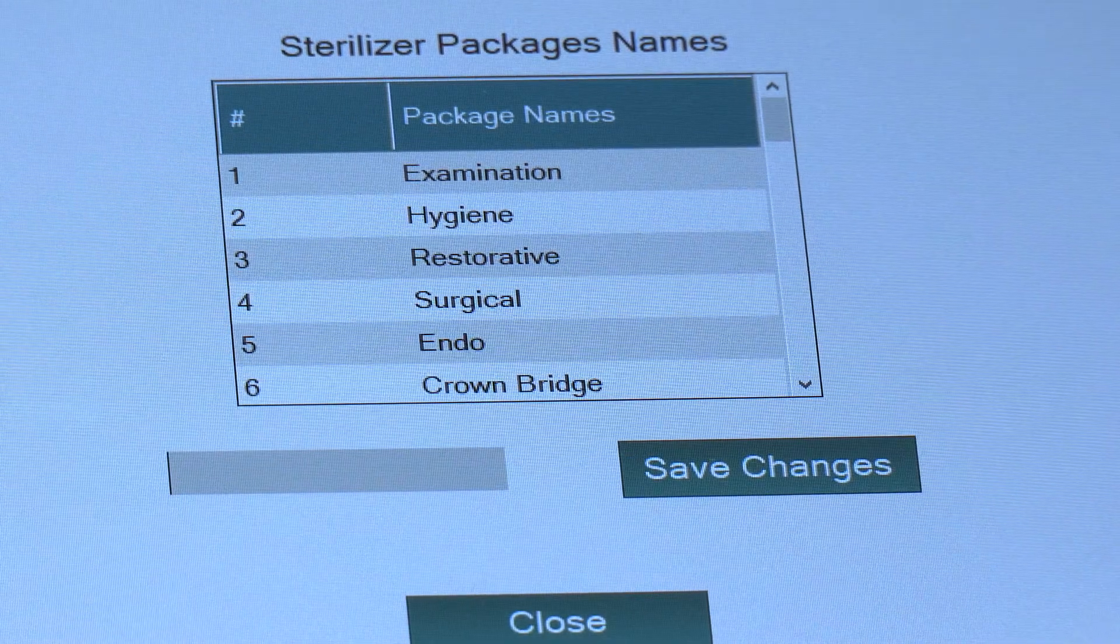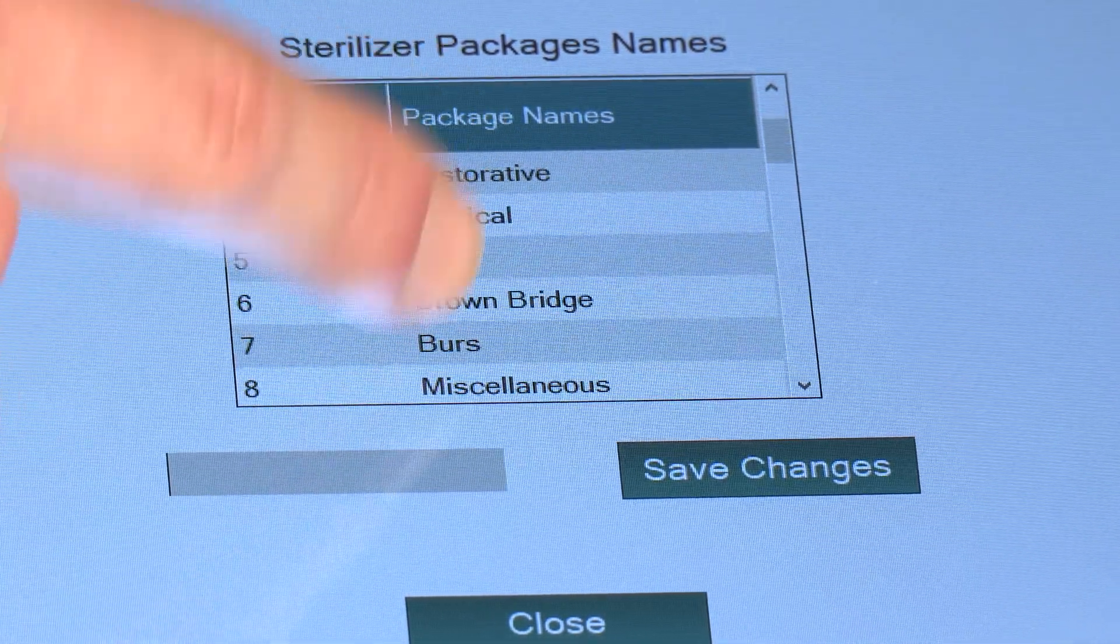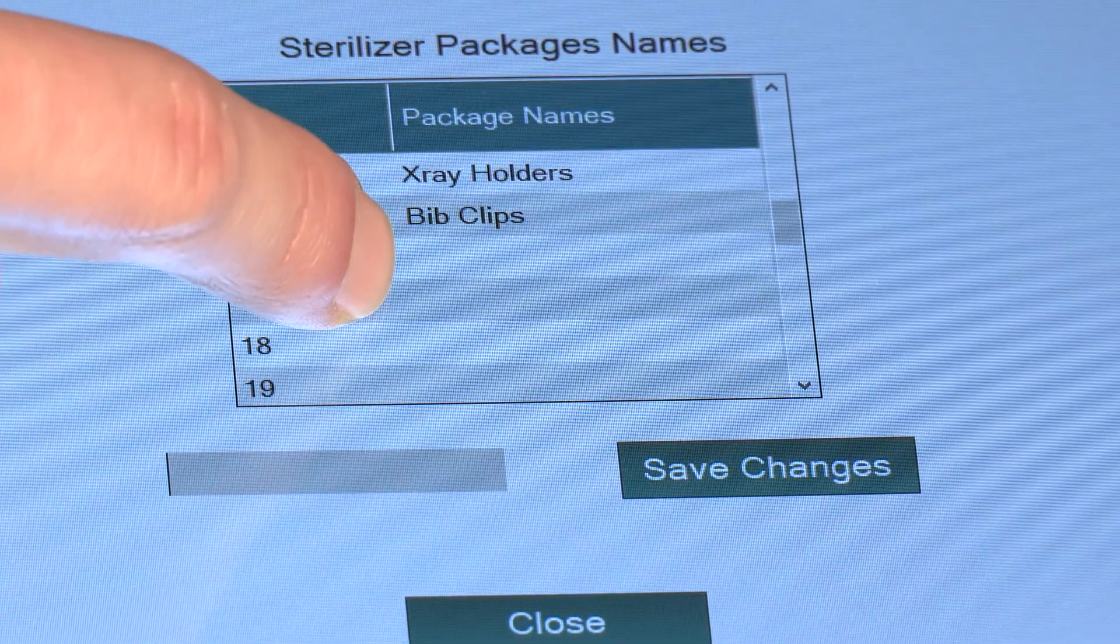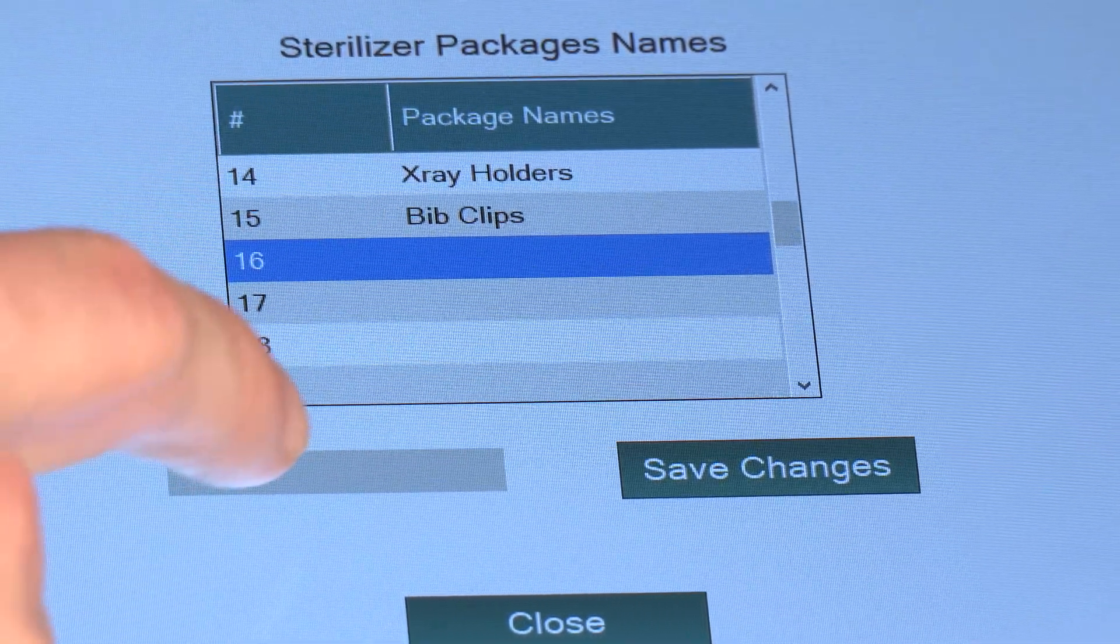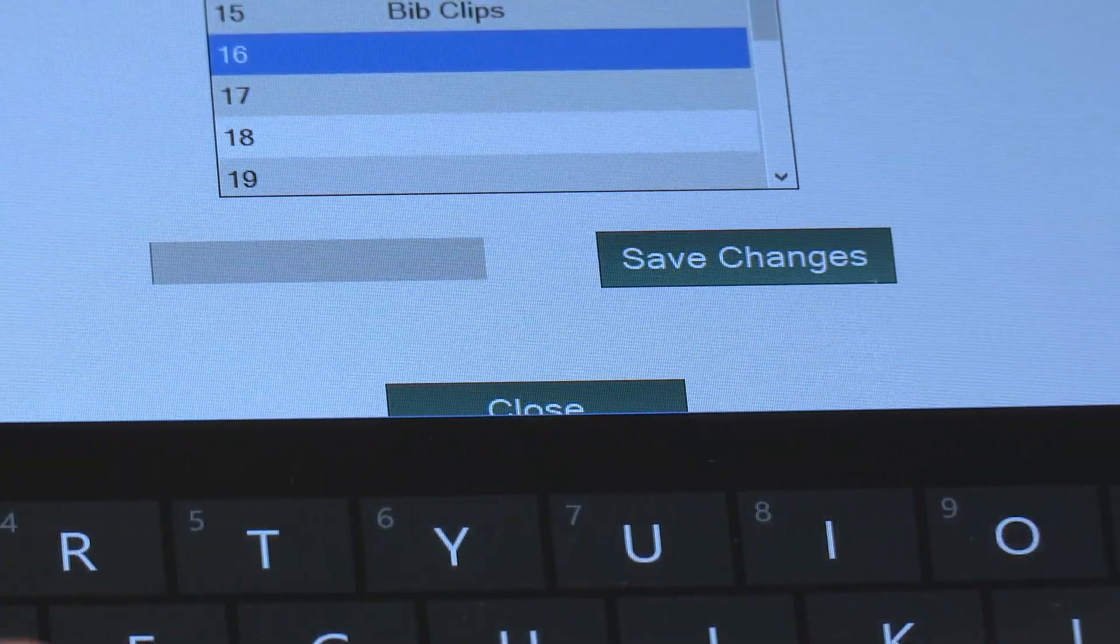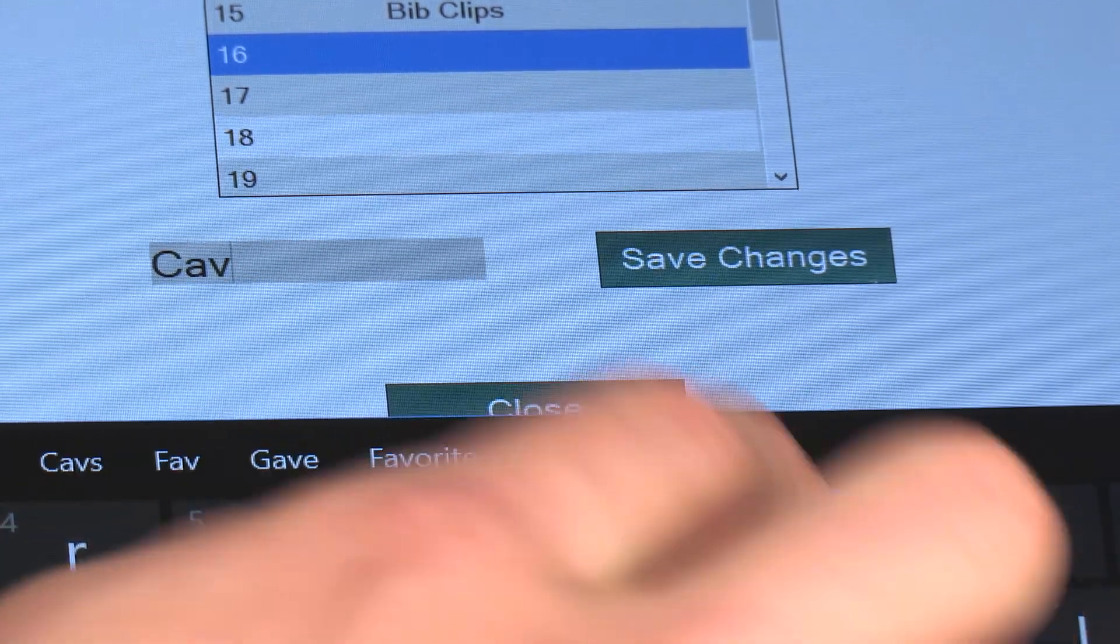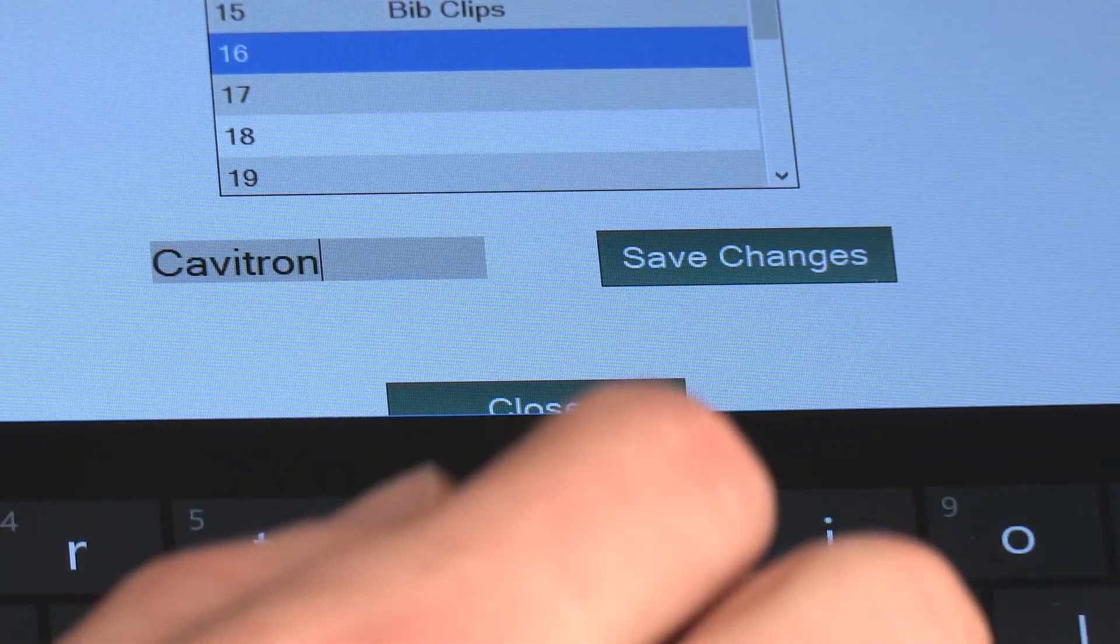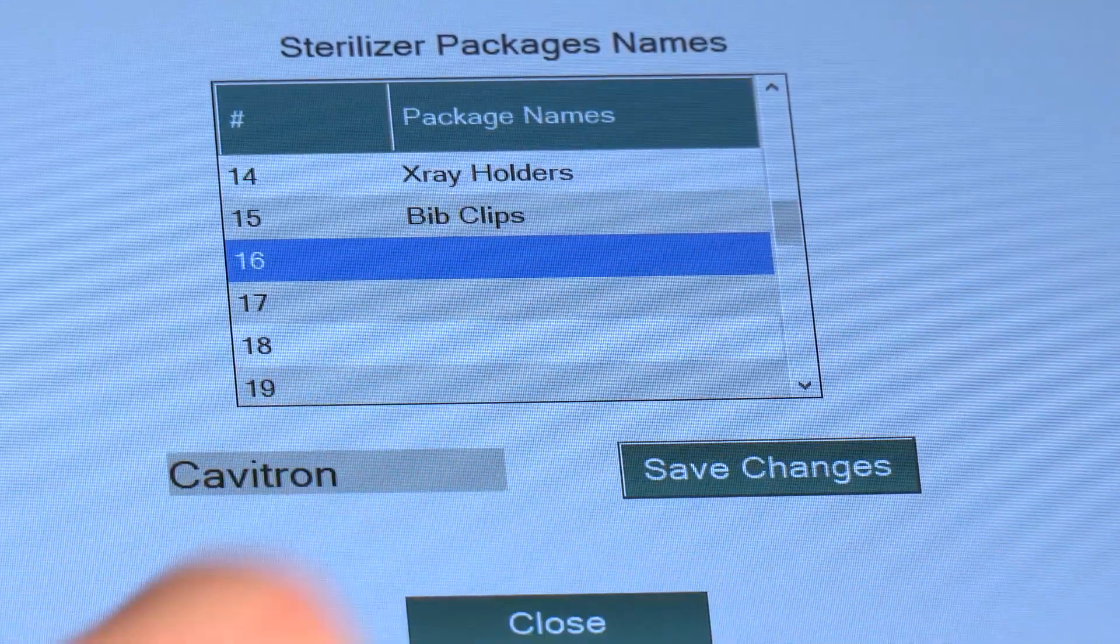To add an instrument name, simply scroll down to a blank field, select the field, then key in the name of your instrument and hit Save Changes.